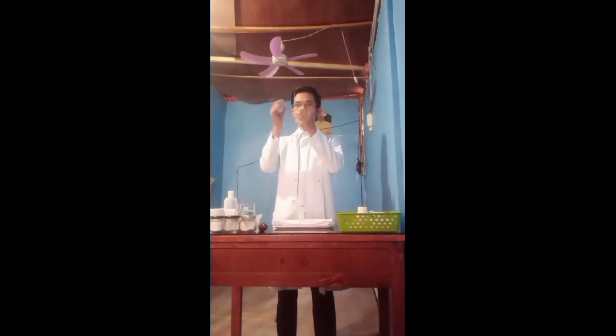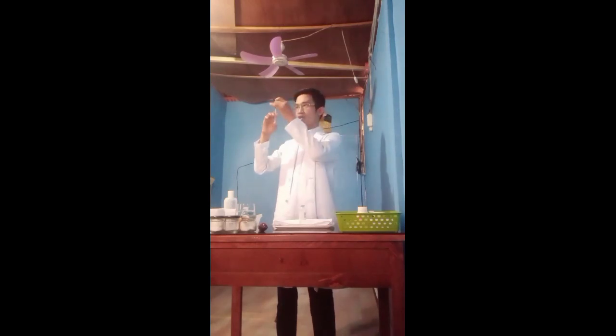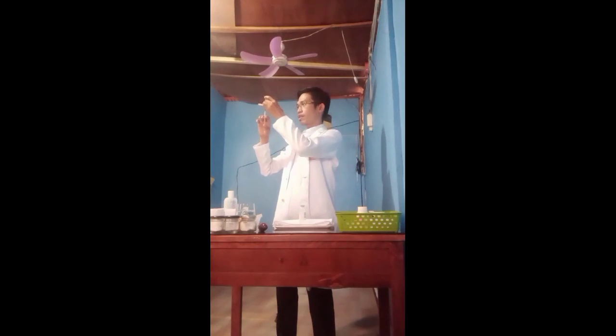You just need to ensure that there is no air or bubbles inside. Okay, so it's already good.